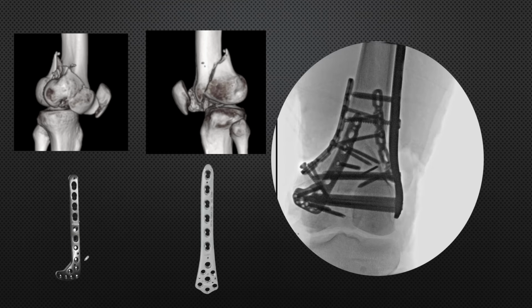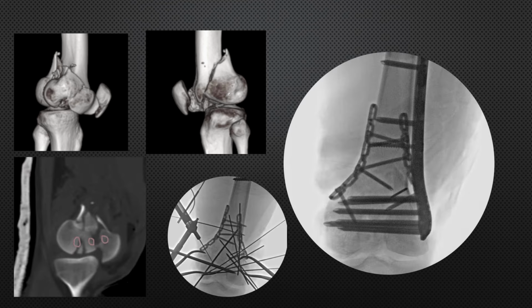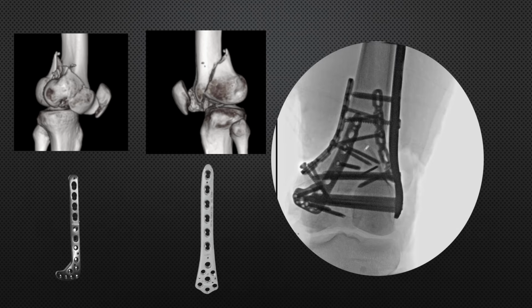So the option is that we can use the ipsilateral anterolateral plate of proximal tibia for the distal part of the medial condyle of femur. So you see here we have good draft, and also the contour of the plate can be easily placed over the medial condyle. The medial condyle is prominent like this, and this part closely matches the shape of the anterolateral surface of the proximal tibia. So we use the anterolateral proximal tibia plate on the medial side.